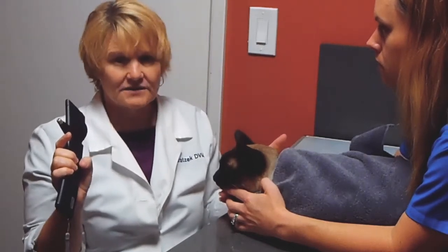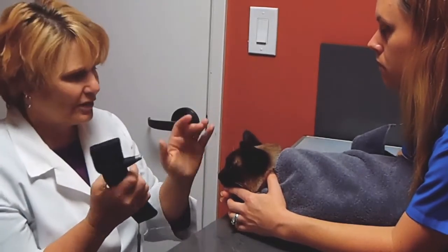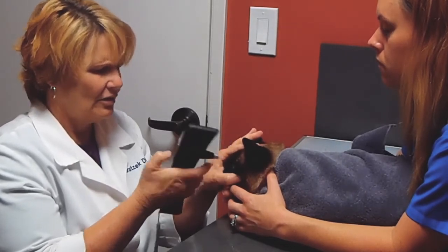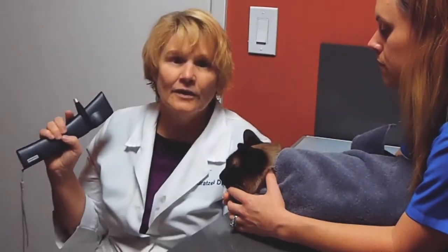It gives me an average pressure of 17. The pressure in a cat is anywhere from 12 to 30, with pathological changes above or below that. She's got 17 and 16 — normal pressures. Your normal Bubbles, and that's it.